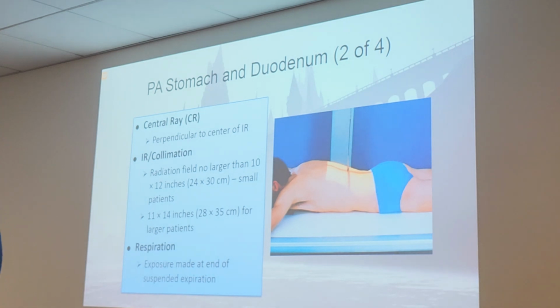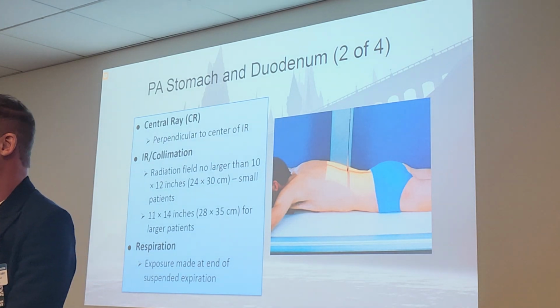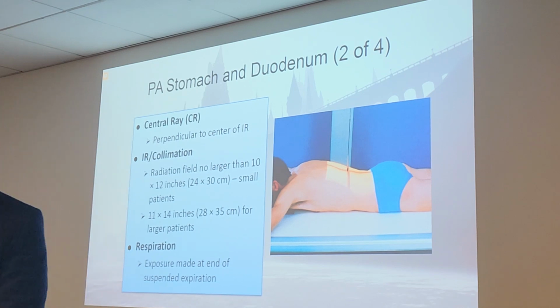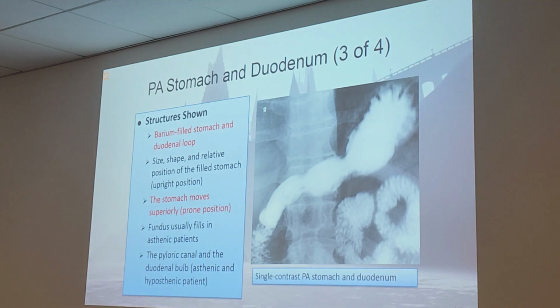Perpendicular central ray, guys, and we make this exposure at the end of suspended expiration. So just like an abdomen, we're looking at the abdominal area. We take it on expiration. So what are we looking at? The barium-filled stomach and the duodenal loop, also called the C loop.